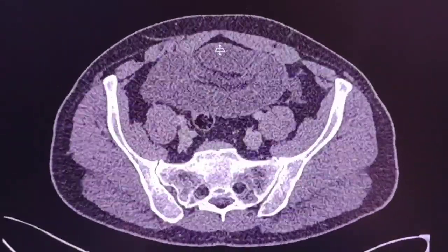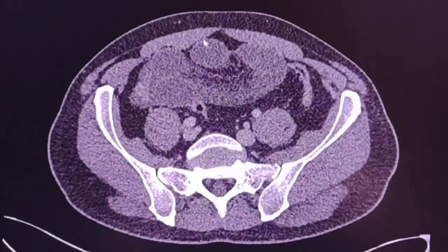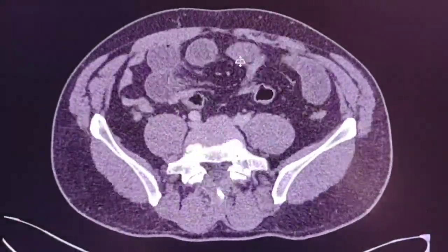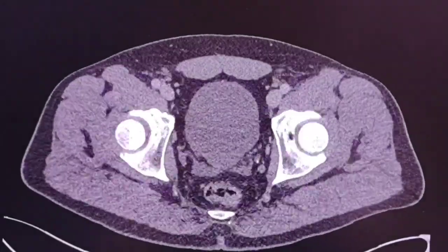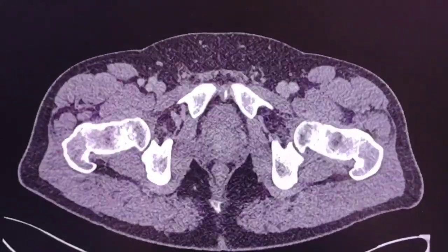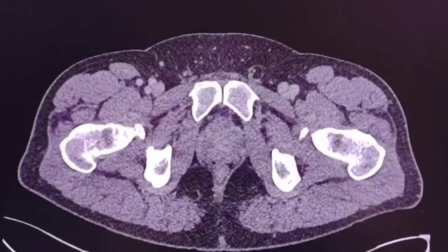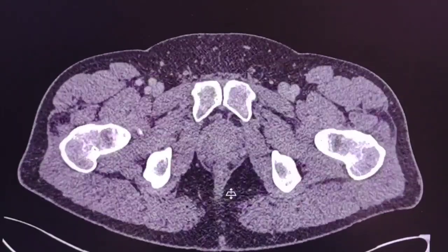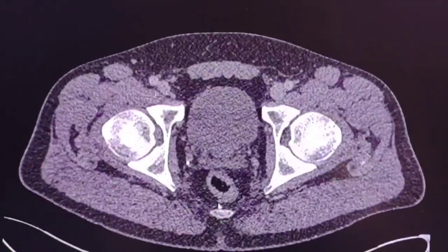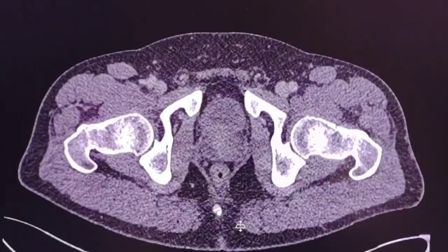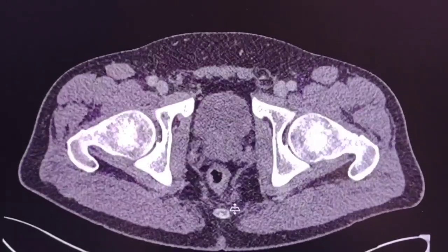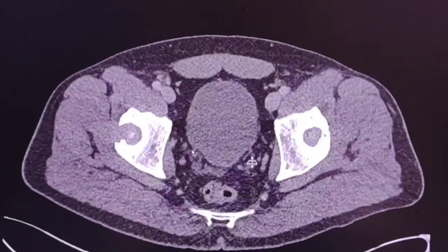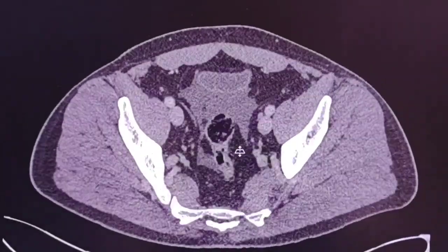We can see dilated small bowel loops. I will remind you that when we search for bowel obstruction, we must check the large bowel starting from the anorectal region very carefully, to see if there is any mural pathology.